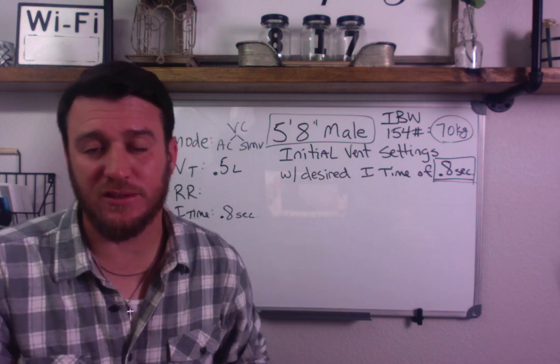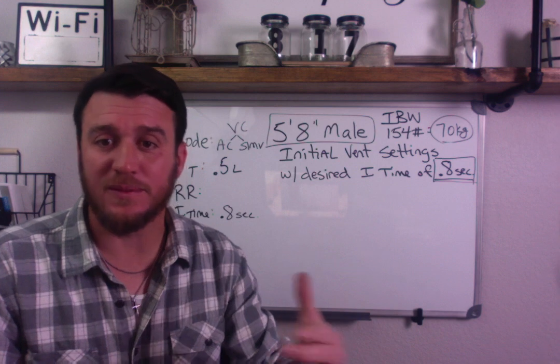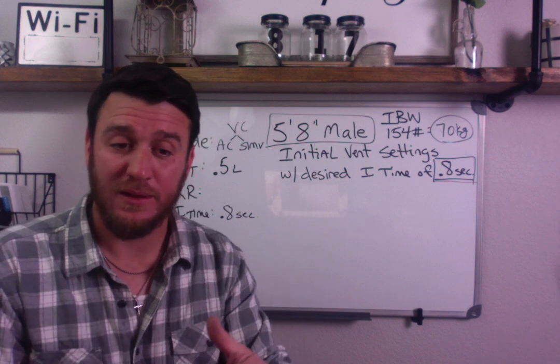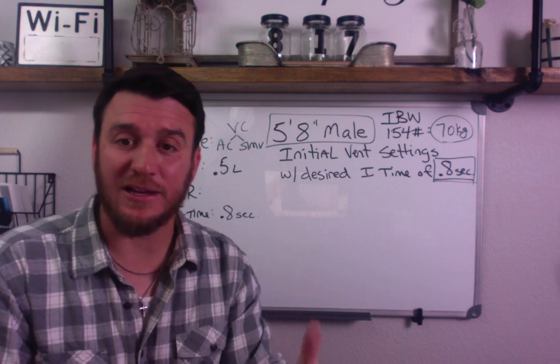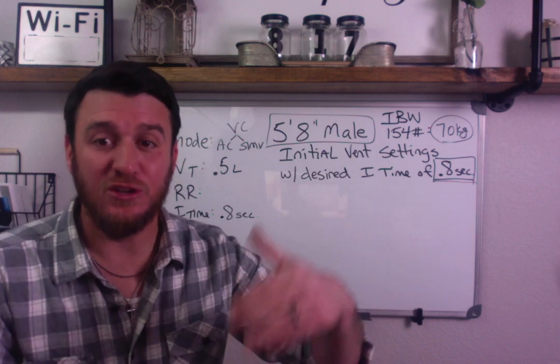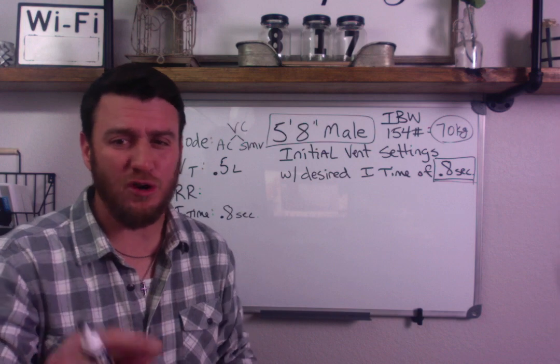What you must understand from a respiratory therapist standpoint is that if you have I time and tidal volume, then you can calculate flow. If you have tidal volume and flow, you can calculate I time. And guess what? If you have I time and flow, you can calculate the tidal volume. So there's multiple ways to do this. You just have to know one formula.